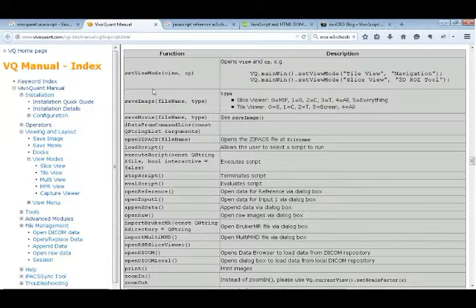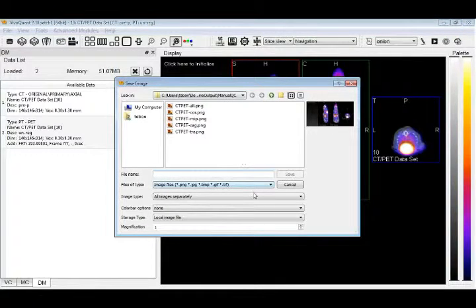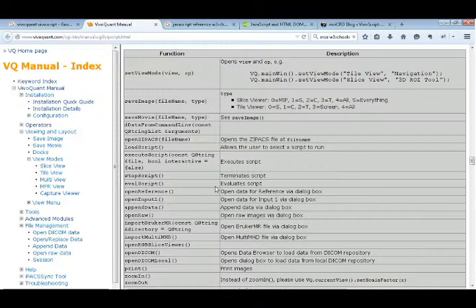All and everything, not the most descriptive wording. But we know that these match up to my dialog over here. So basically those numbers correspond to which index they are here. This is the 0th one, this is my MIP, this is the first one, or number 1, my sagittal slice, and so on. And we chose to save all images separately, so we'll continue to do that here in our script.